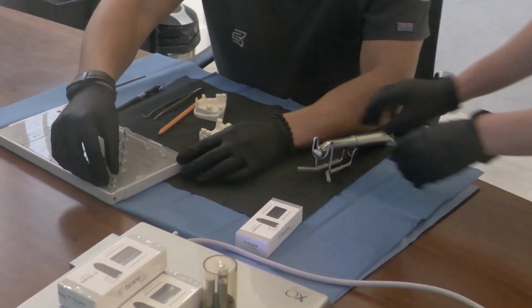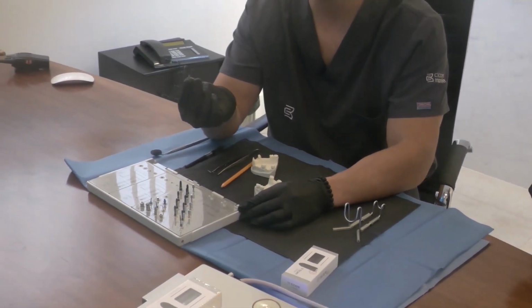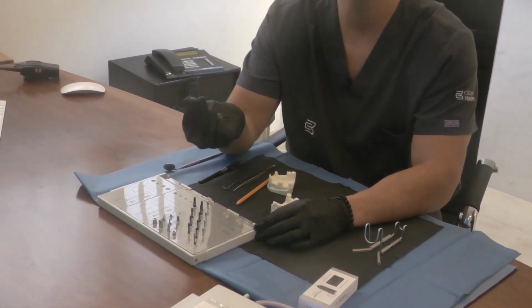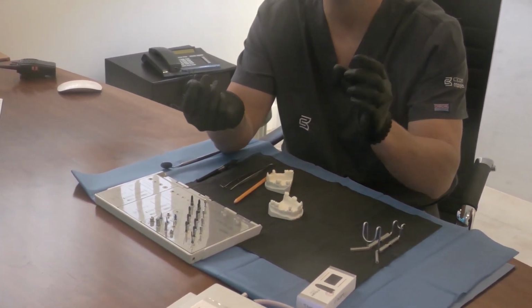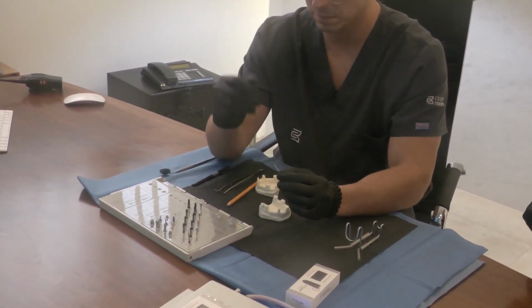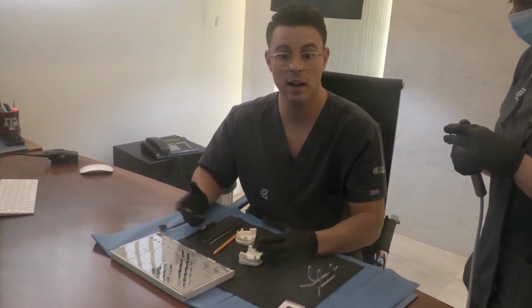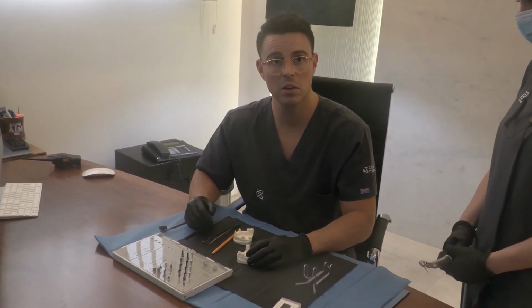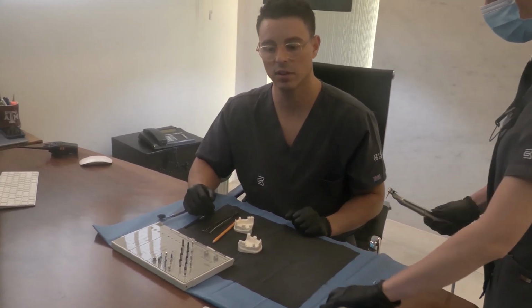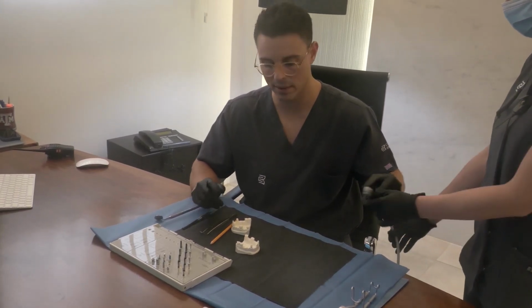For that, the first burr to be used is the pilot drill. With this, it is desired to dig only up to 4 or 5 millimeters. So the entire length should not be drilled until the second drill, which is going to be the 2 millimeter drill. It is suggested to apply about 900 to 1100 revolutions per minute during drilling in order to place these bone level implants.